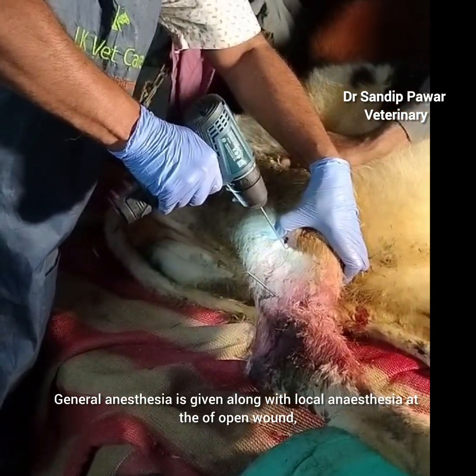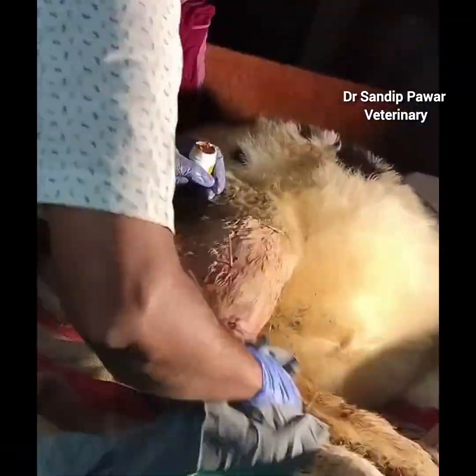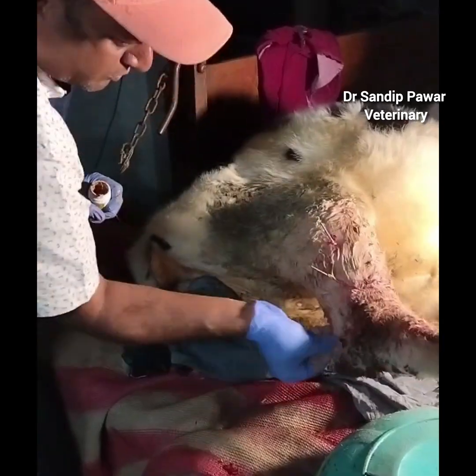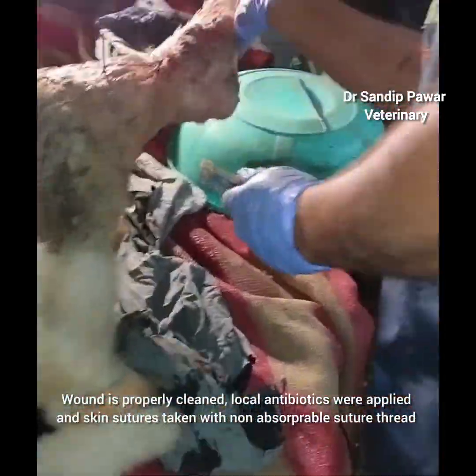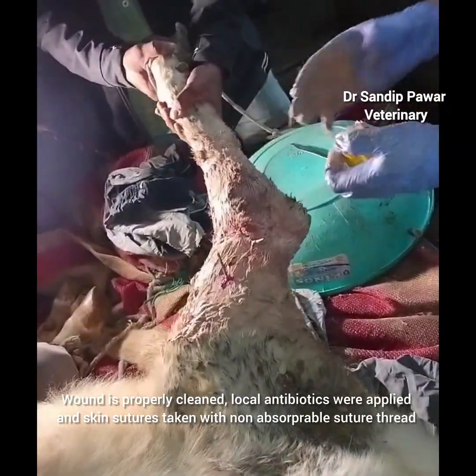General anesthesia was given along with local anesthesia at the site of the open wound. The wound was properly cleaned, local antibiotics were applied, and skin sutures were taken with non-absorbable suture thread.